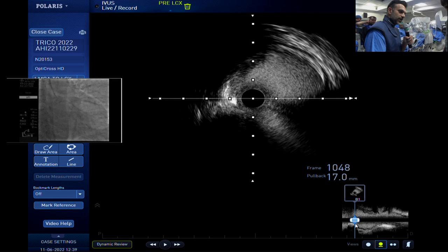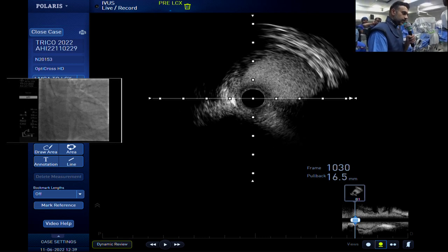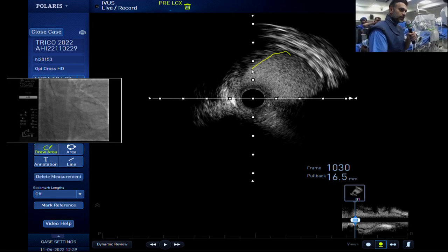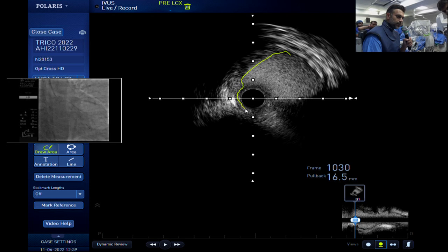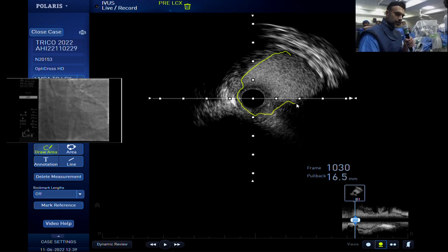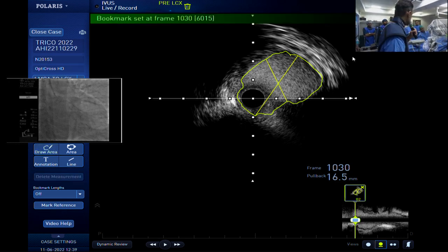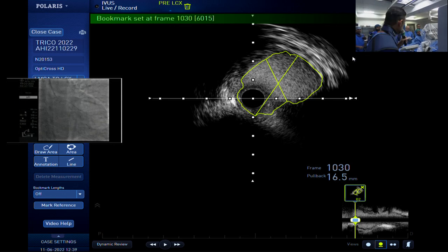So if you end up finding roughly this point, which is probably your tightest, you can even do a straight draw area measurement, right? Where you can start here and you can create the contours yourself. At this point, you have a great handle on the plaque. And this is probably going to be your most conservative area assessment. And it's still 8, yeah. Right? So you're quite comfortable leaving the left main alone.